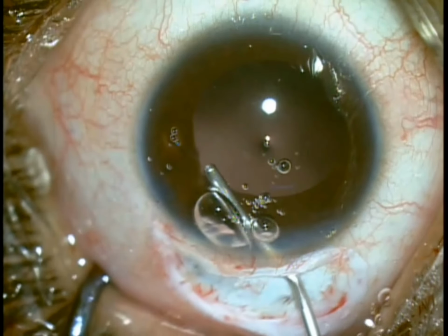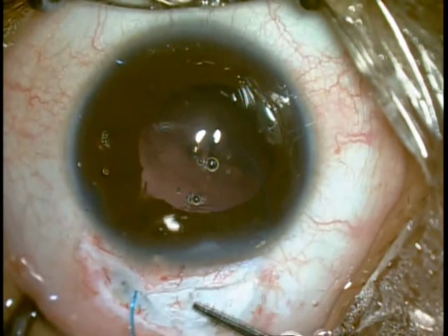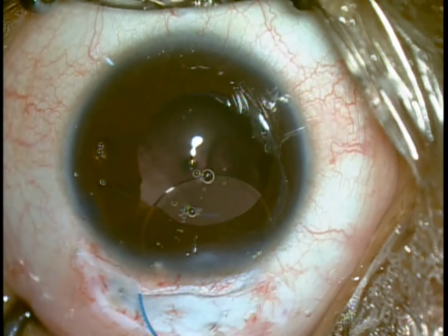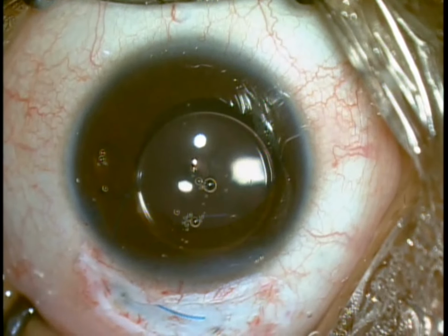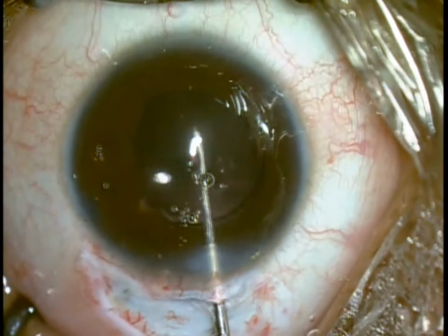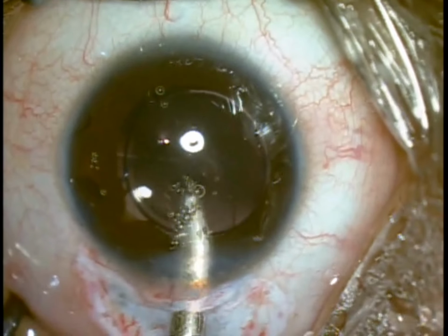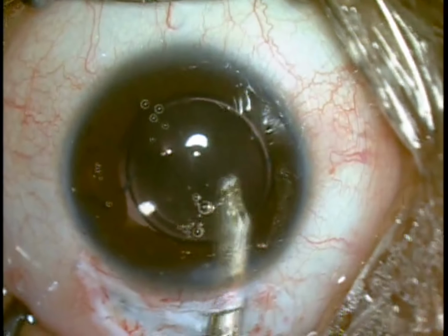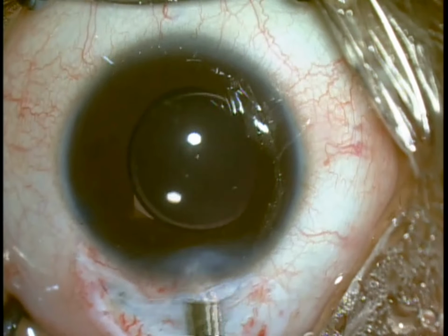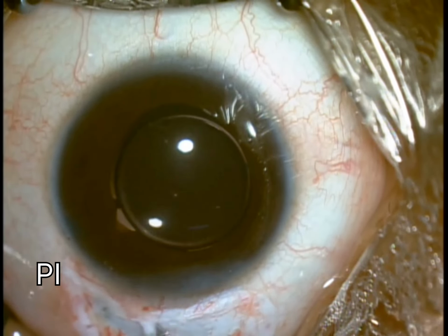At this point, it is to be noted that the status of the bag temporally and the capsular support is unknown. Therefore, a 3-piece posterior chamber intraocular lens is implanted in the sulcus. After a thorough visco-wash, peripheral iridectomy done with the vitrector at 2 o'clock position.